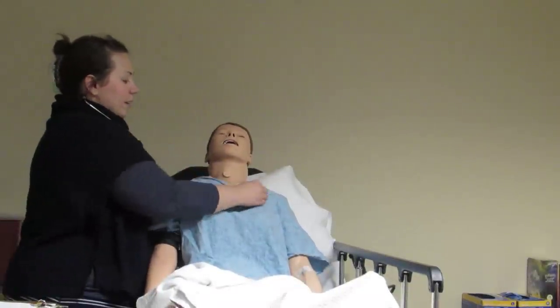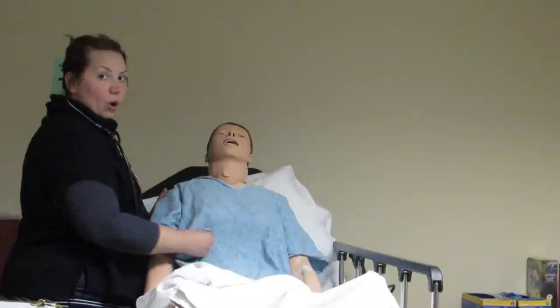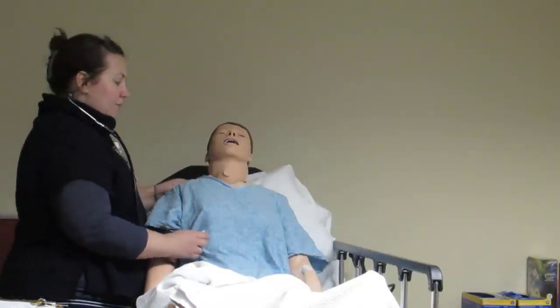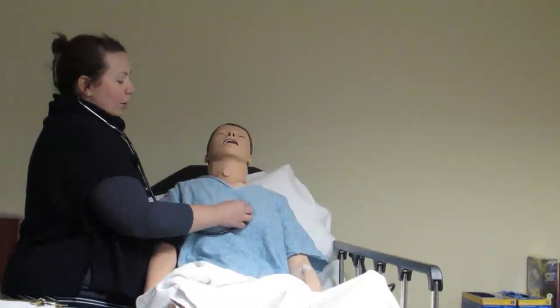Here, move over, down, over, okay? Then you go out a little bit, okay? Down the front of the chest, I'm going to listen up here, and I'm going to move in a little bit farther. So you can listen down the front of the chest.